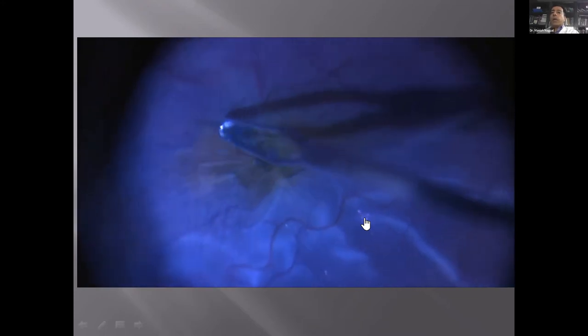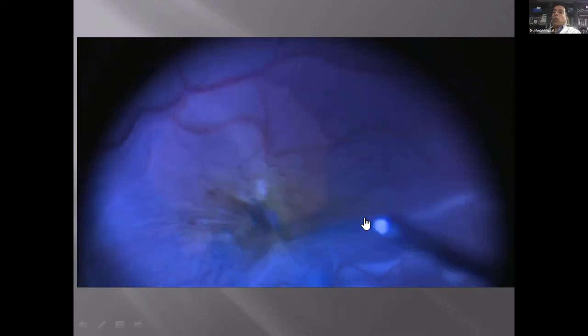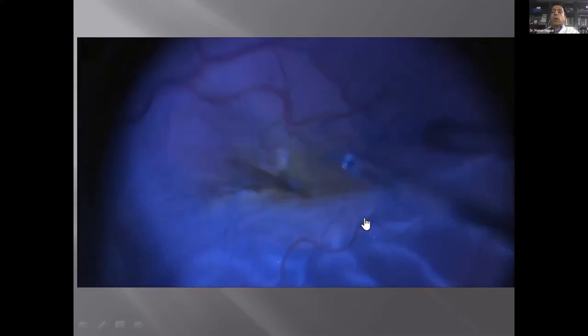After removing the pucker from the detached retina, you can see residual striae. We then stain with brilliant blue dye and gradually remove the ILM from that area. ILM removal on a detached retina can be awkward because unlike a flat retina, the retina is moving. At times we use PFCL to give support — if you think it's easily possible without adjunct, go ahead; but if the retinal mobility is interfering, stain first, then put PFCL and remove the ILM.